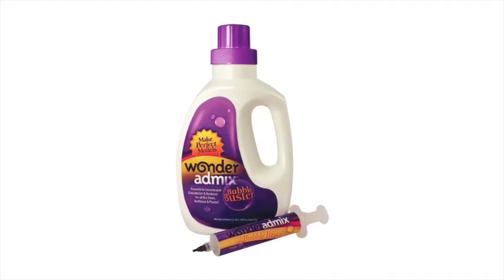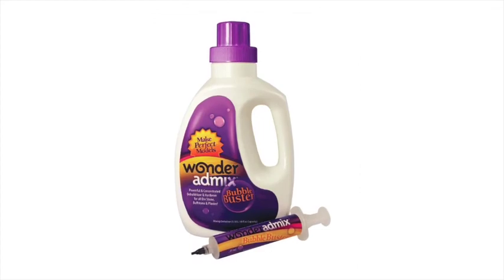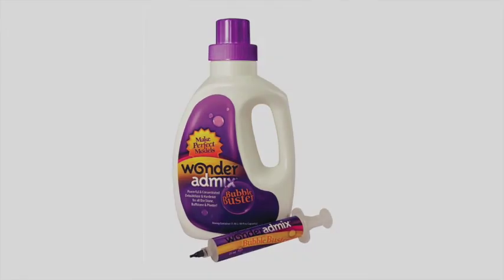You need to shake it just before you're going to use it because the material tends to particulate, and you want to make sure you keep it mixed before you mix it with your stone. Wonder AdMix is a product used in place of water, and it reinforces the properties of the stone.